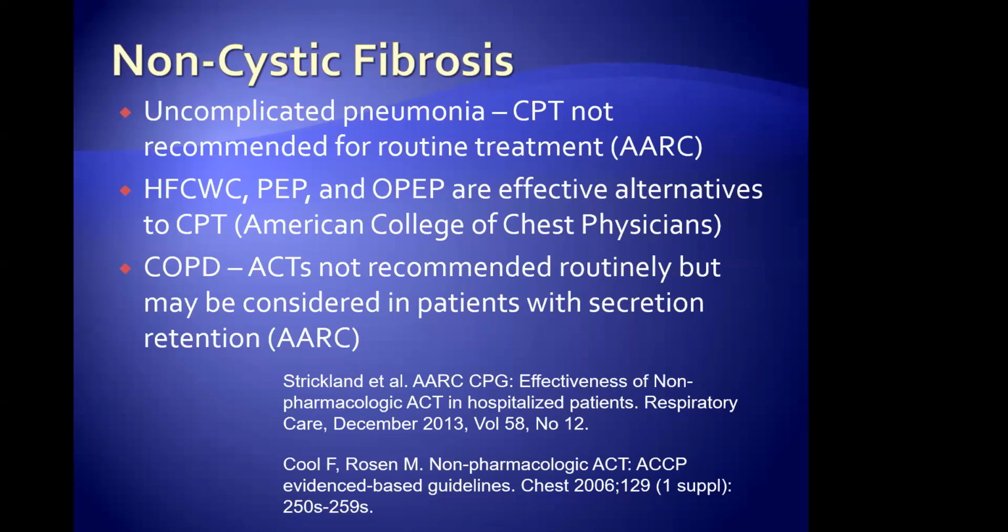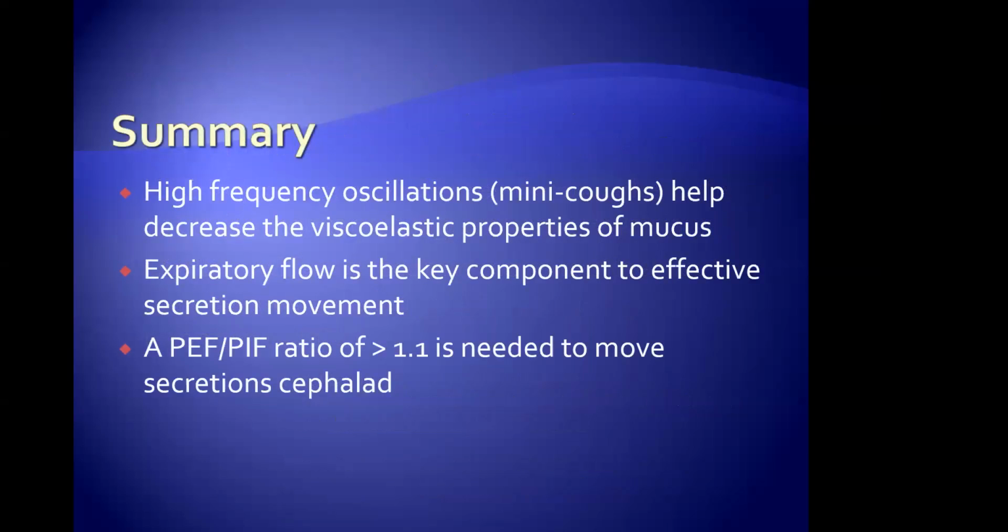Every day. So in summary, high frequency oscillations, mini coughs, help decrease the viscoelastic properties of mucus. Expiratory flow is the key component to effective secretion movement. And then here it is. I need that bias.